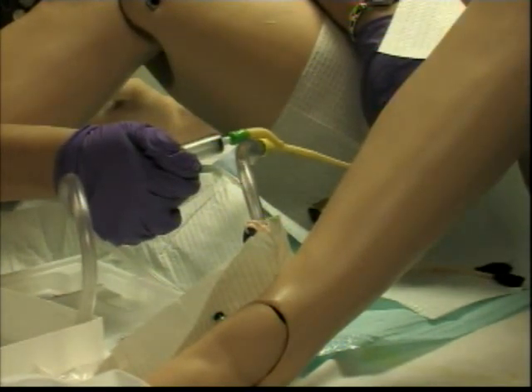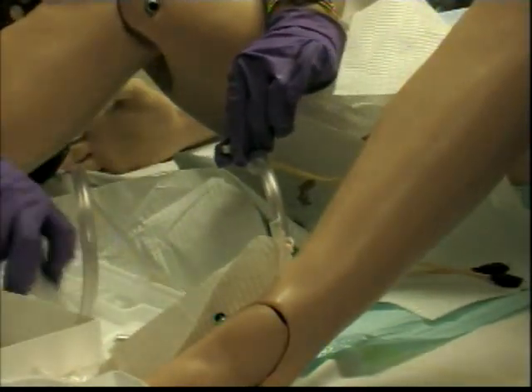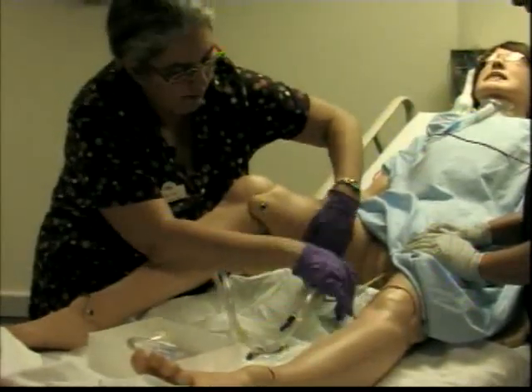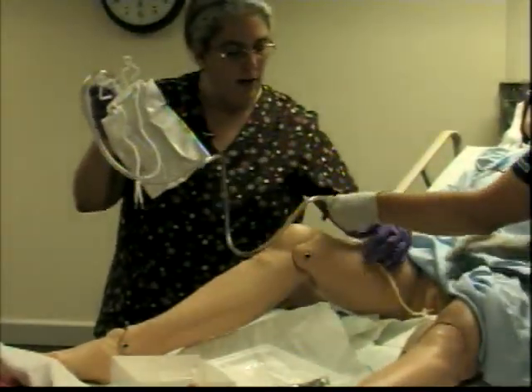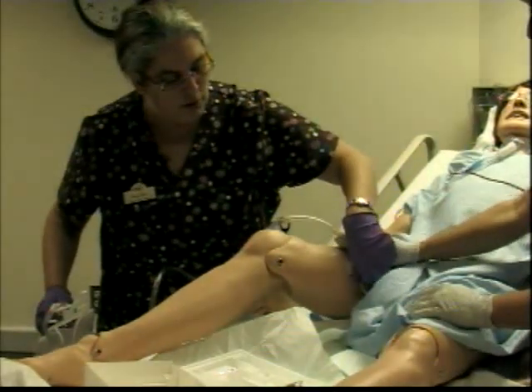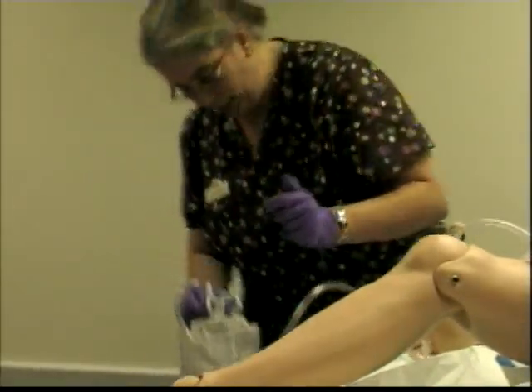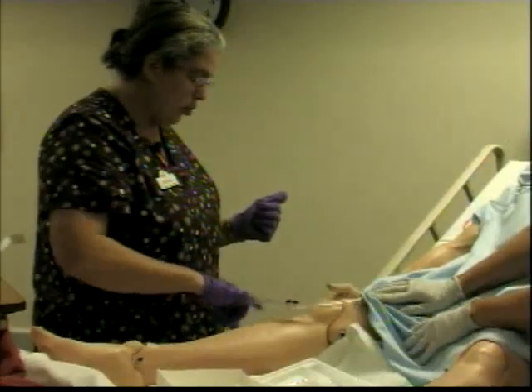Once you've put all the water in, give it a little tug to make sure it's in place. Then you can let go, hold the catheter, and remove your syringe — you see the urine coming through. Put the client in a comfortable position. Tape the catheter to the side of the leg using commercial packaging, Velcro, or regular tape — give some wiggle room so the client isn't tugging on it. The drainage bag must hang below the waist on a non-movable part of the bed, not on the rail.